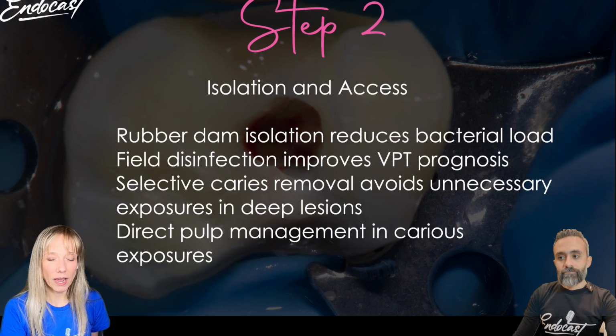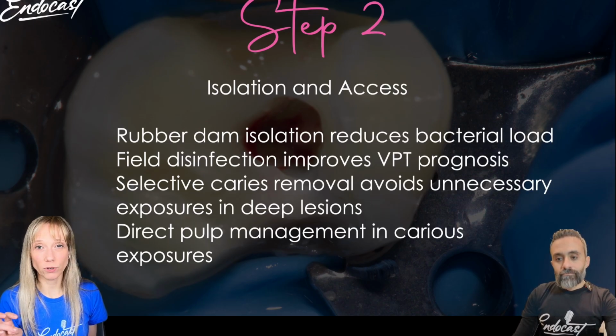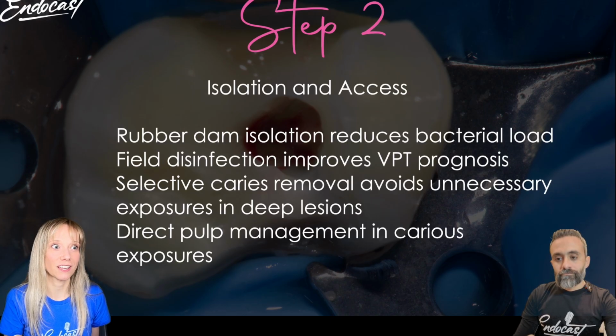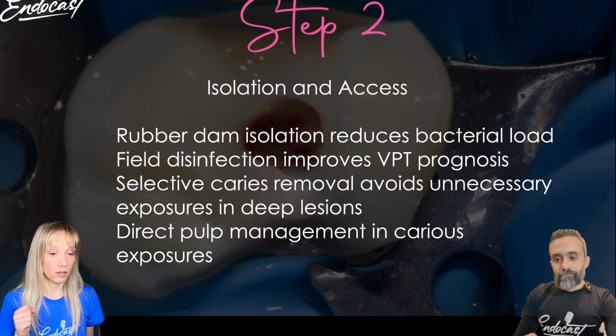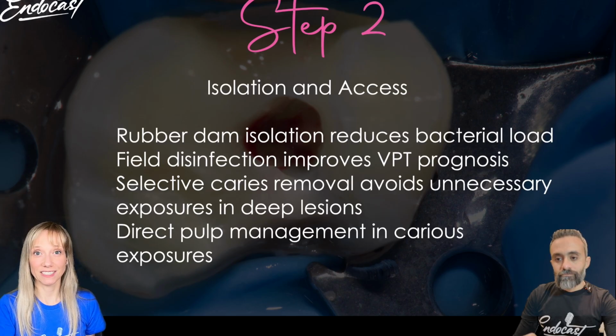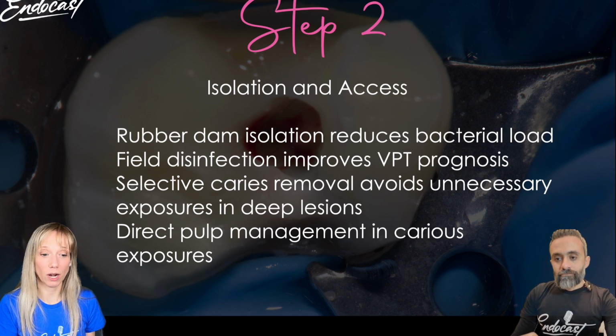But try to put in your mind that the most important thing in this case is to act in an environment which is as free as possible from bacteria. So a good rubber dam isolation is the key to have success, because we have to reduce as much as possible the bacterial load.